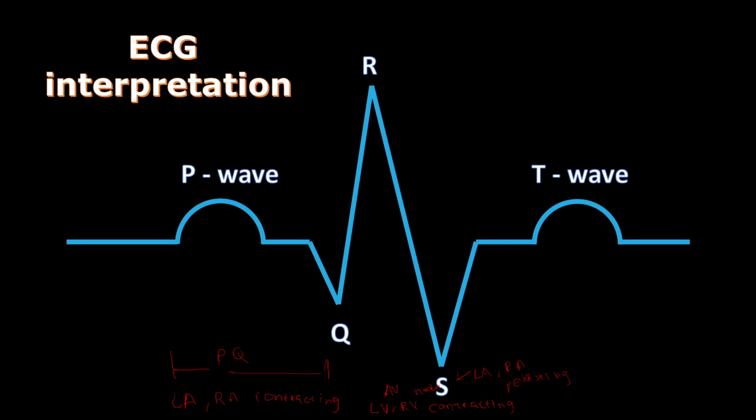Okay, so now let me describe the ST segment. The ST segment reflects when the ventricles pump blood. So let's say that during this time, the left ventricle and right ventricle pump blood. Okay, during this segment.